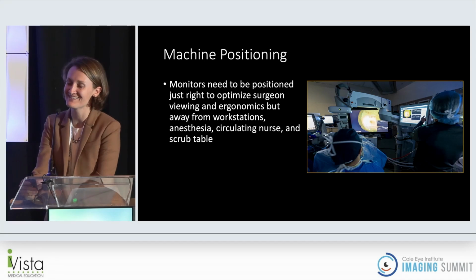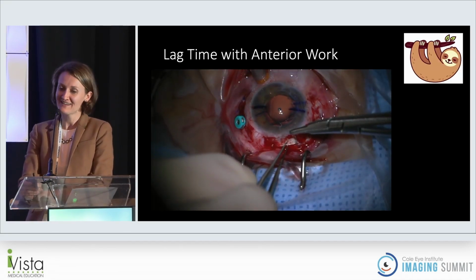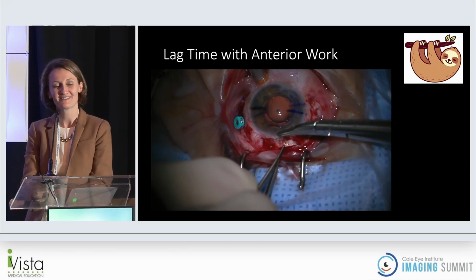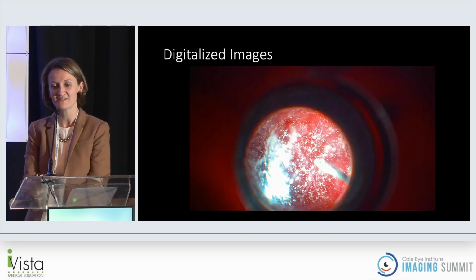You also need to make sure that the machine is in just the right position. There's a lag time with anterior work that can make doing cases like scleral tunnels and suturing a little difficult, especially as you're trying to compensate for that.